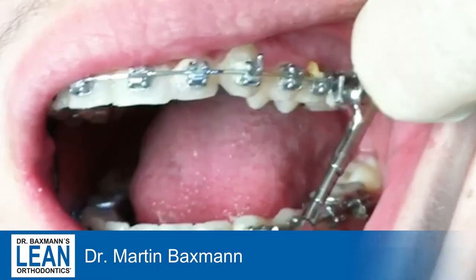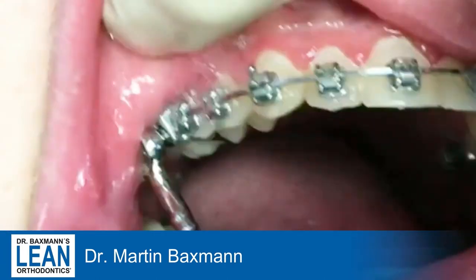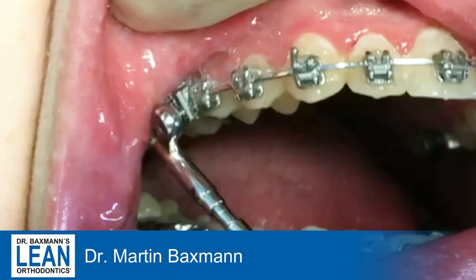See how we bite together. And as fast as you could insert it, you can remove it as well.